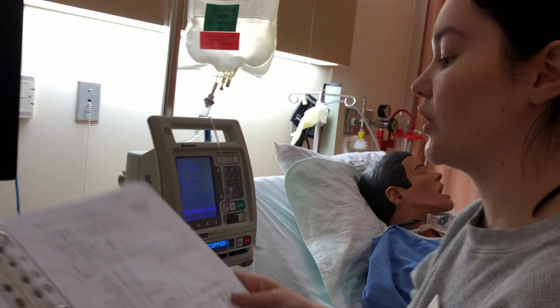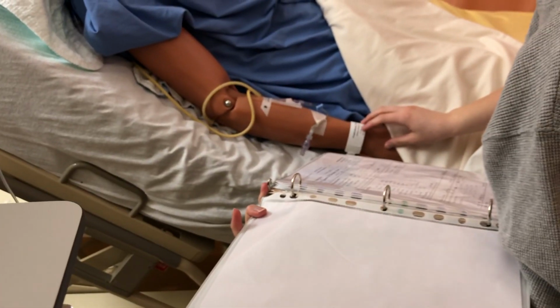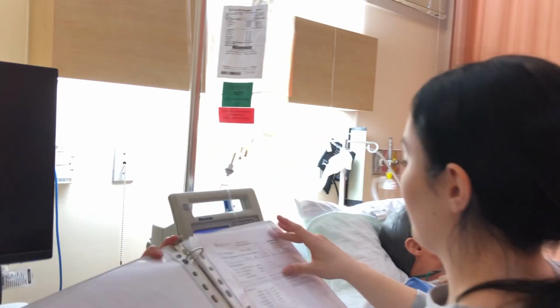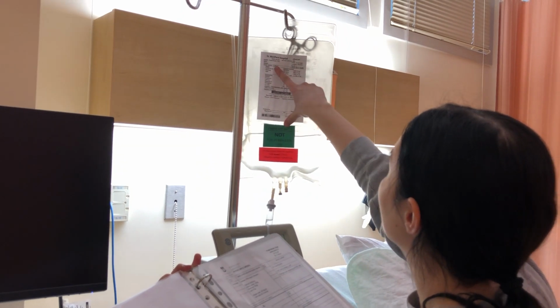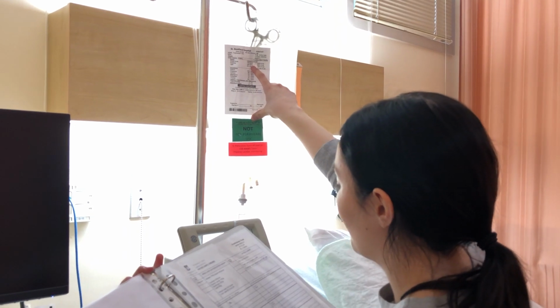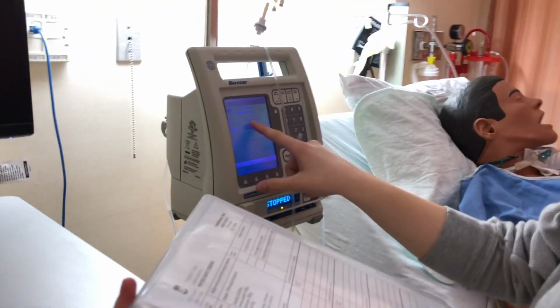So now I'm just going to do another check with the pump. Okay, so I'm going to check. I have Fredrickson, 0990127. So that matches up. I'm doing just a check with, again, my physician orders. I have a 2,000 ml bag, so that's right, 100 grams of amino acids, 200 grams of dextrose, and 50 grams of lipids. So that's all good. To infuse over 24 hours, which gives me a rate of 83.3.